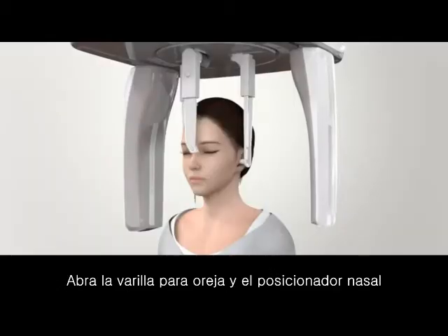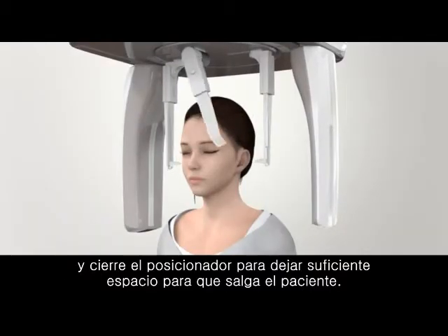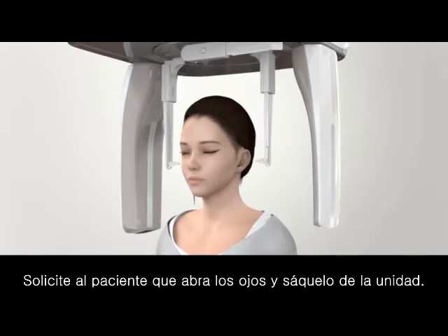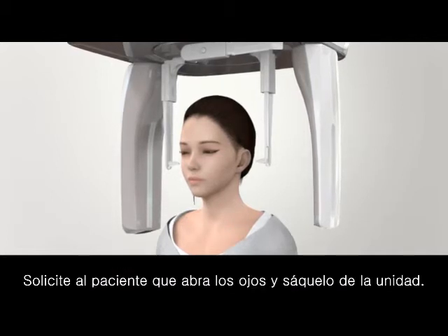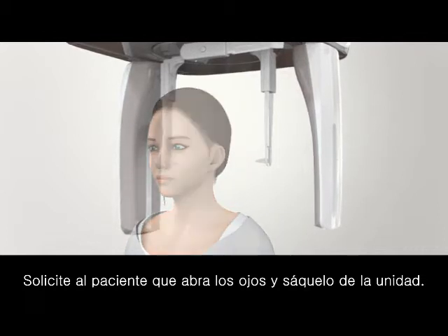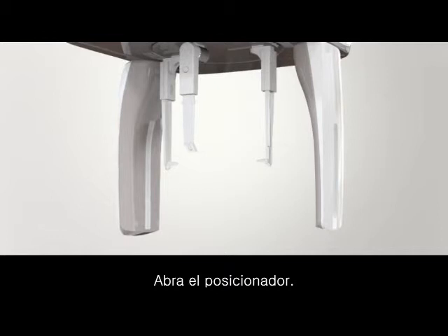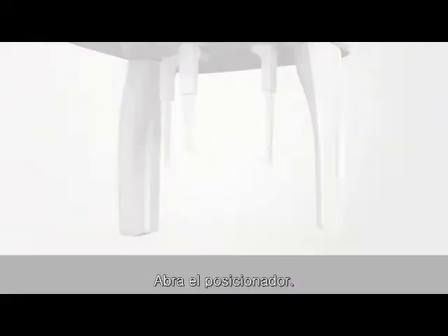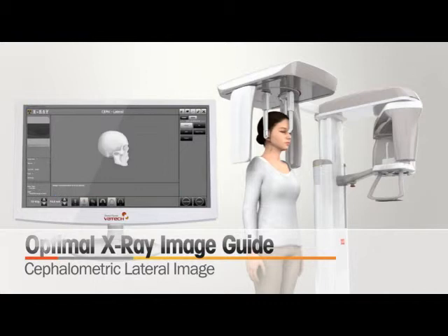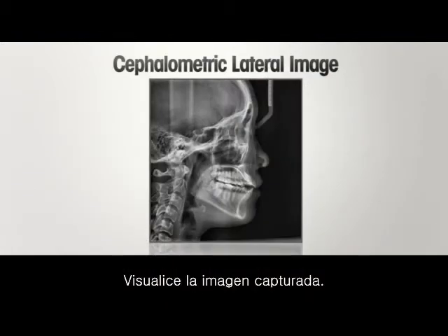Open the ear rod and the nasal positioner and fold the positioner to make enough space for the patient to exit. Ask the patient to open their eyes and guide them out from the unit. Unfold the positioner down. Check the captured image.